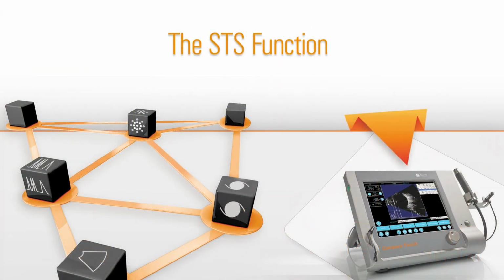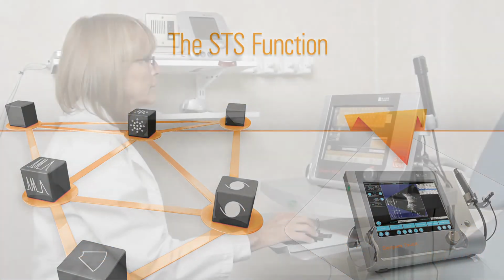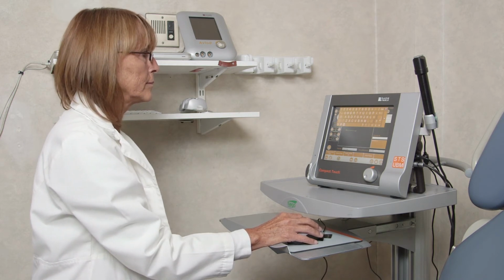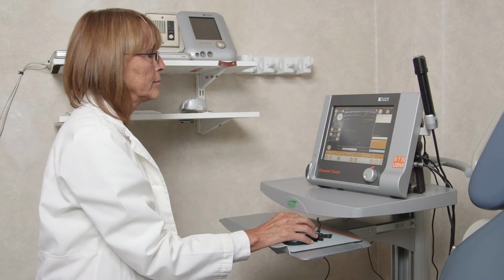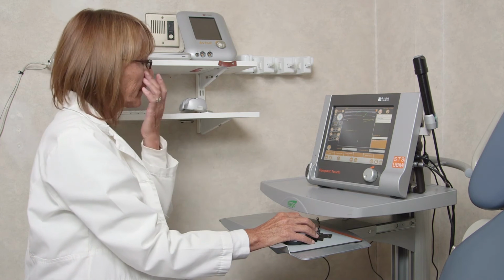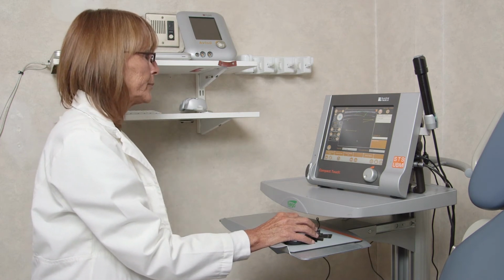The STS function. The Compact Touch STS UBM allows surgeons to take automatic measurements of sulcus to sulcus distances to select the most suitable posterior chamber phakic IOL or implantable contact lens. The software enables sizing of the lens and simulation of its placement between the sulcuses.